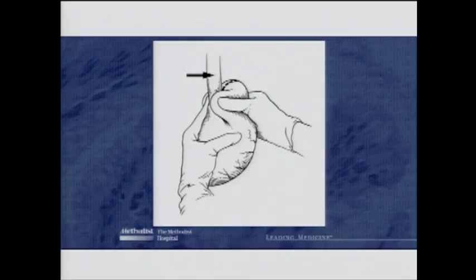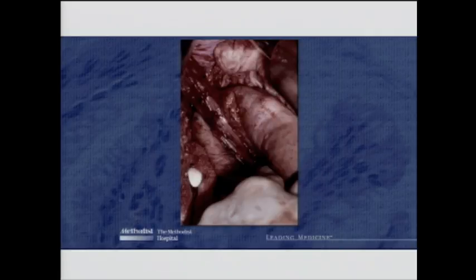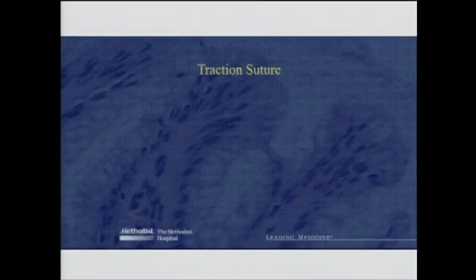And this is the problem with laparoscopy, because this is how I learned to do a fundoplication from my mentor, Paul Jordan. We'd stick a right hand in there and put the short gastrics into the palm of your right hand, take the bougie filled esophagus, just push your finger and dunk it into your right hand, and it always created a very nice, correctly oriented fundoplication. But, and that's a picture that Paul gave me from back in the open era. But you can't do that with laparoscopy, and so I'm going to show you how we do that.